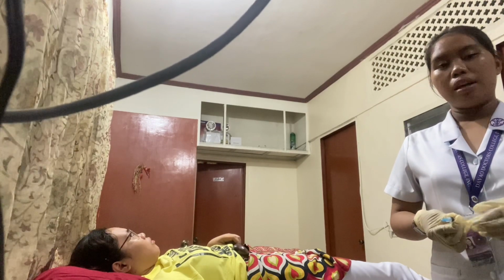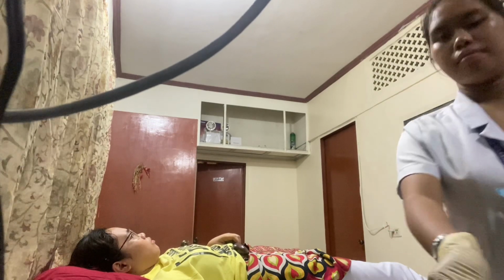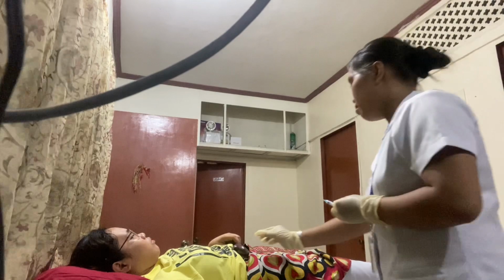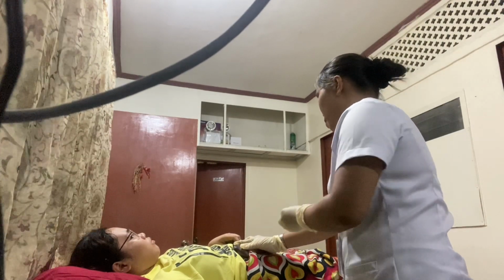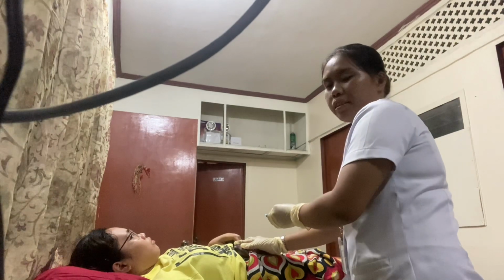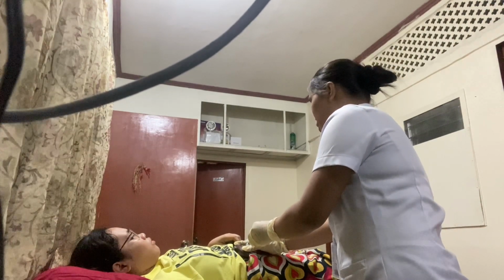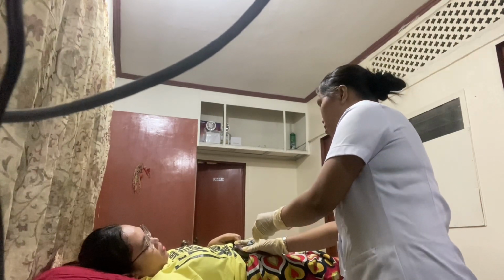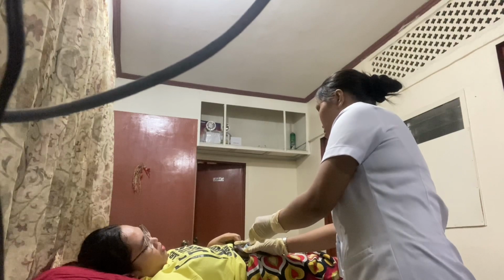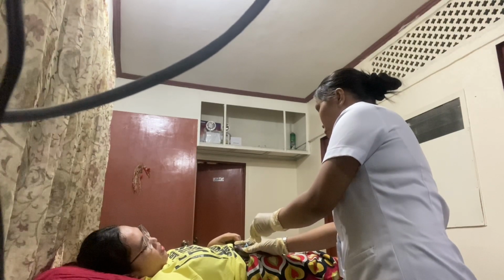grab the syringe and using the non-dominant hand, pinch the skin. So when the needle is inserted, move the non-dominant hand. So inject the medication by holding the syringe. So when you're holding the syringe, just imagine that you hold a dart. So this is to minimize discomfort.